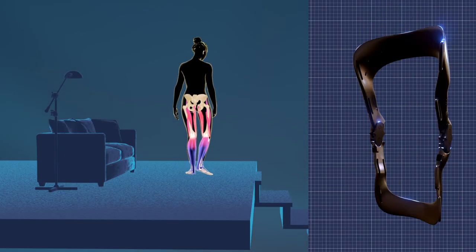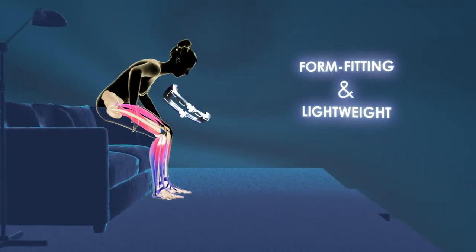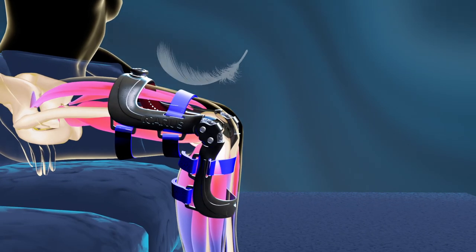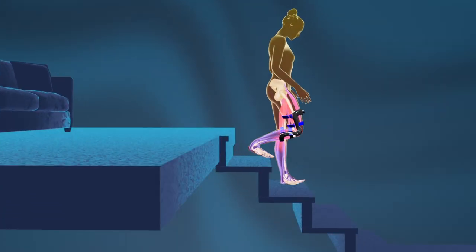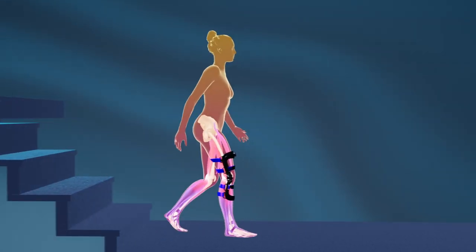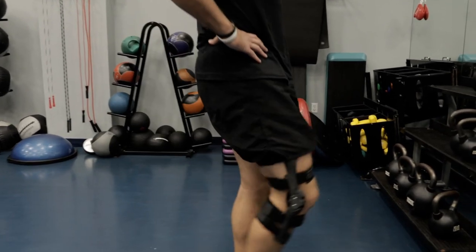Introducing the Ascender Brace by Icarus. The Ascender Brace is a state-of-the-art, form-fitting, lightweight support system for your knee to unload the extreme pressure we put on our knees each day. The Ascender Brace is the newest technology for an age-old problem, and it will help you get back to the activities you are missing while enhancing your overall performance.